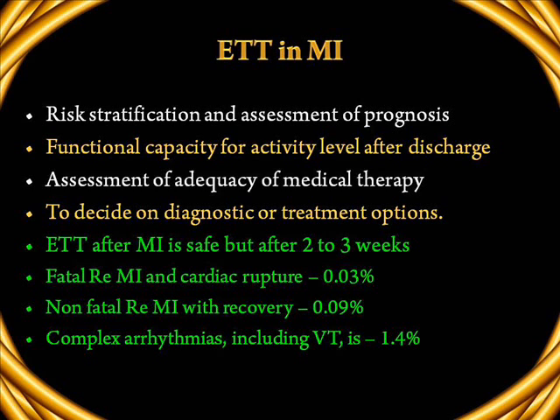Complex arrhythmias including ventricular tachycardia are reported in 1.4% of patients who had previous MI when they are subjected to exercise testing. So, keeping these things in mind, it is important for us to decide whether we go for an exercise testing in a patient of MI, and if so, what is the information that we are going to get out of it, and how we use it for planning the treatment and for prognosticating the patient's future.